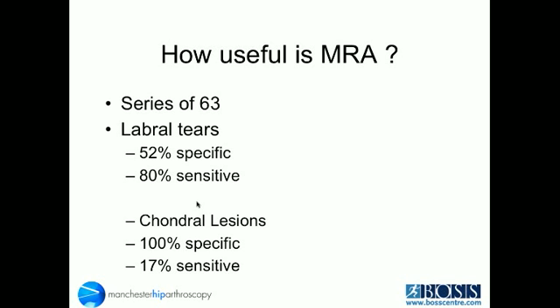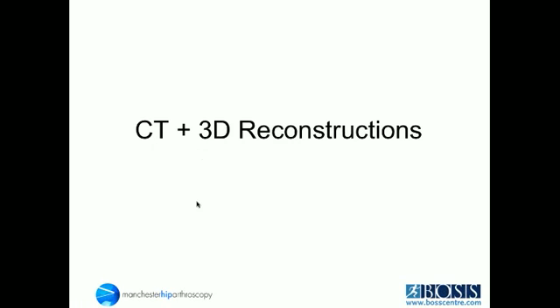So we only use it now for cases that are not clear cut, where the whole clinical picture is a little confused. So we moved towards using CTs, particularly with 3D reconstructions, and I think you need the reconstructions for it to be of any use.